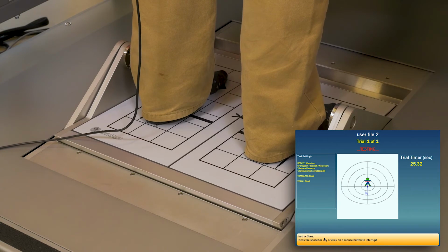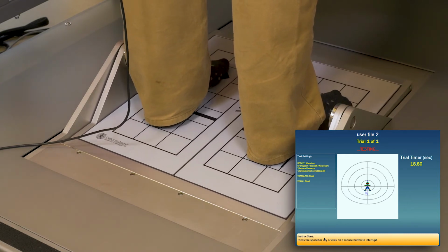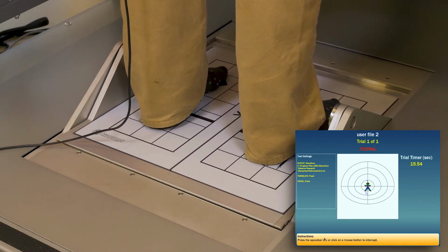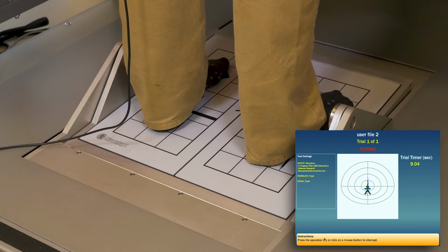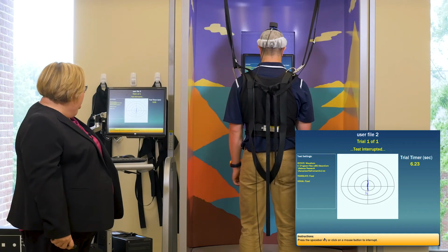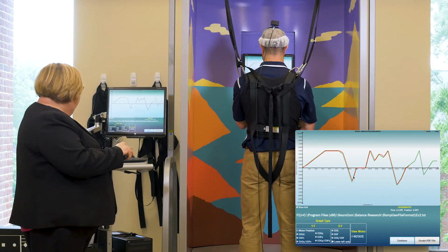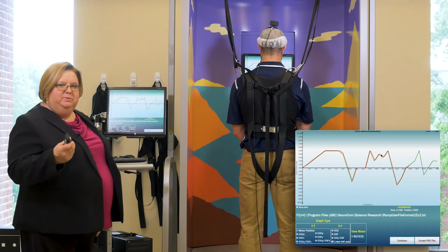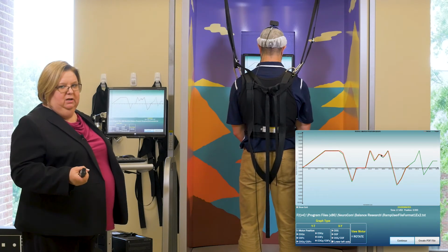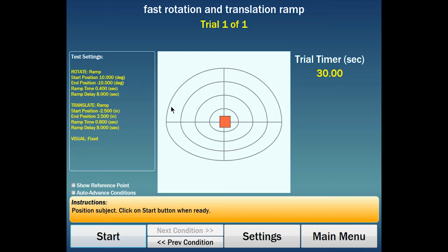So it's hard to tell while he's on it that there's a lot of change. But if you had seen the platform, it looks a little smoother at this point. And I'll show you when we get to the motors that it's smoothed out. So let me go ahead and stop it again. And now you see that it's on, the motors and the position are actually right on top of each other. And so it's really kept to being true to the position, even though it has to sacrifice a little bit of the velocity.